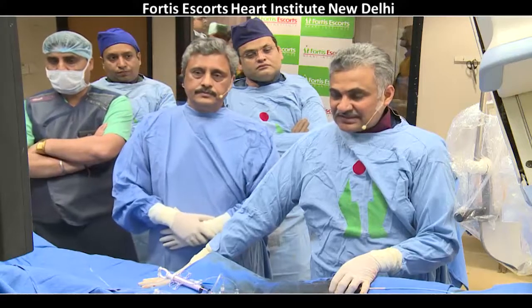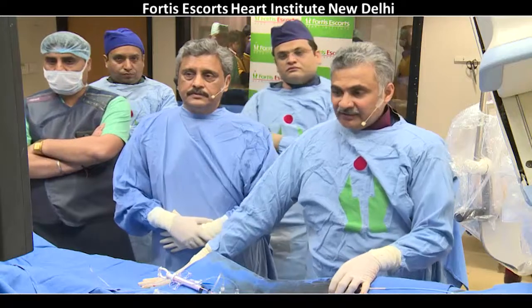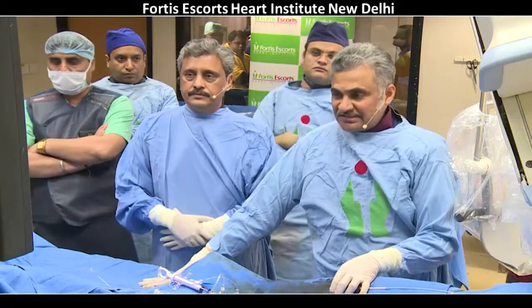You see, the distal vessels are too small to be bypassed. The LAD has diffuse disease, and the PDA all along is diseased.